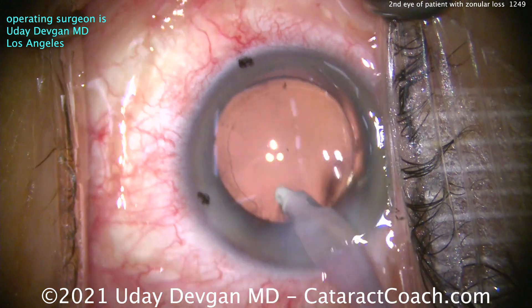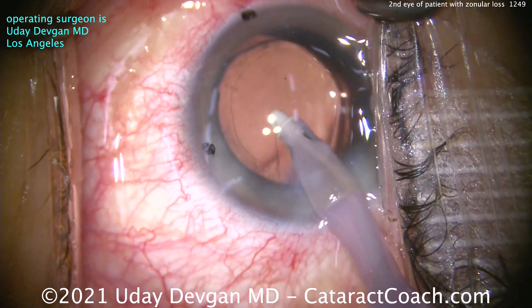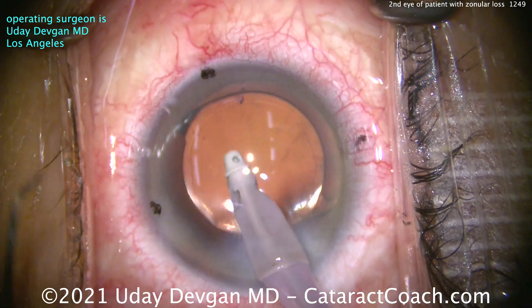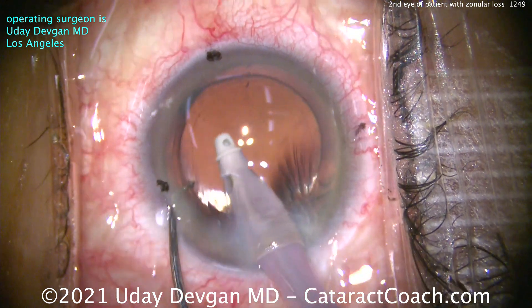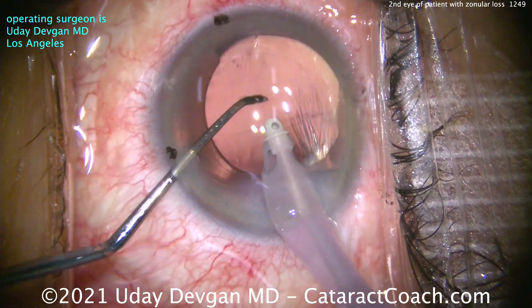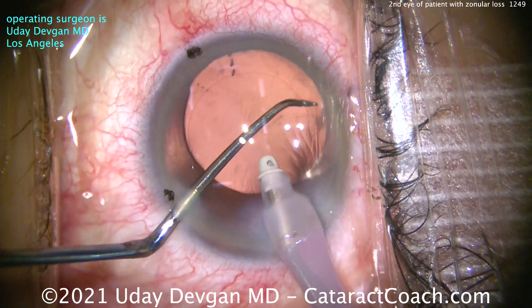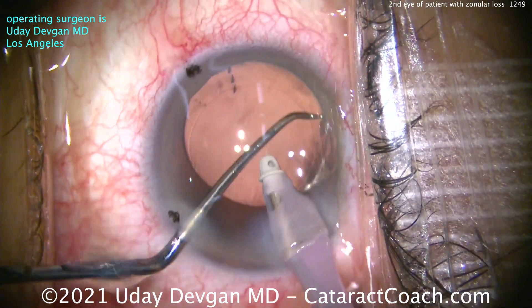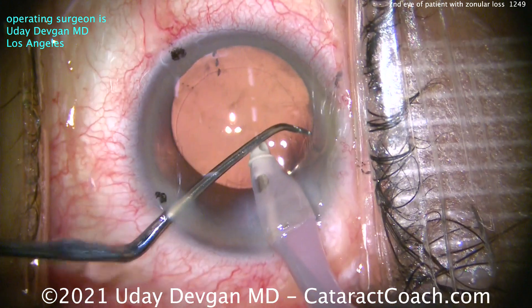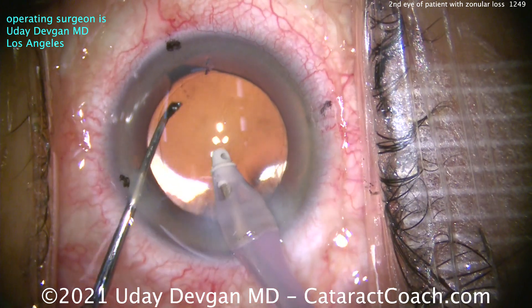I'll polish up a little bit of the capsule bag but not go overboard. I'll clean up all that cortex — a little sub-incisional material left, we'll get that out. You can see the toric lens still needs to be rotated about one and a half clock hours clockwise. There we go — rotate that clockwise a little more. You can see the marks on the cornea. My goal is simple: line up the three marks on the cornea with the three marks on the IOL, and that gives the IOL the correct orientation.